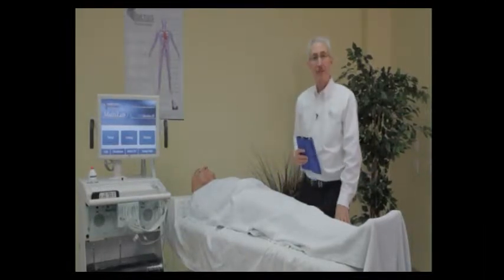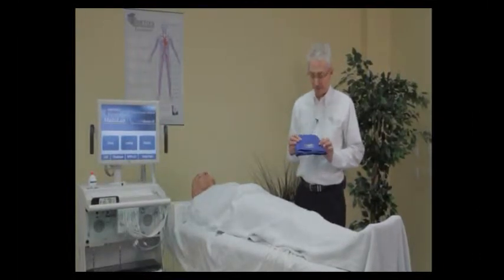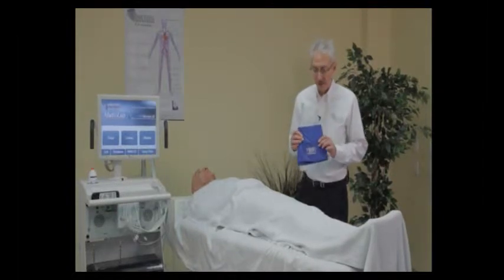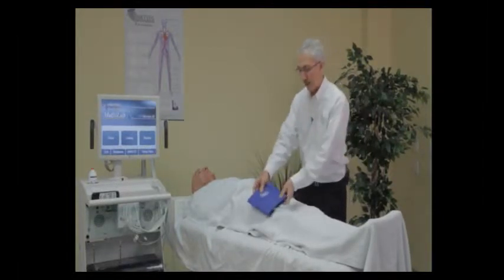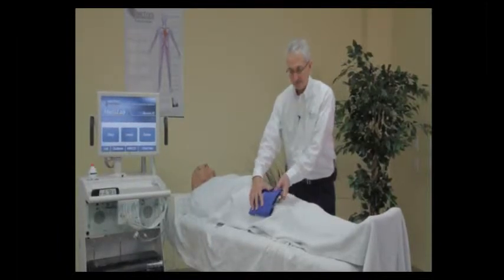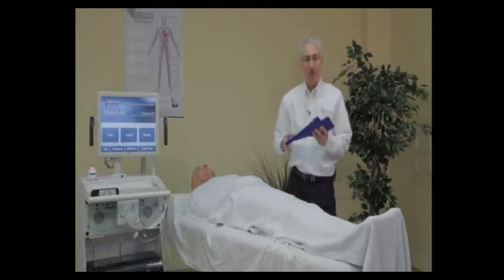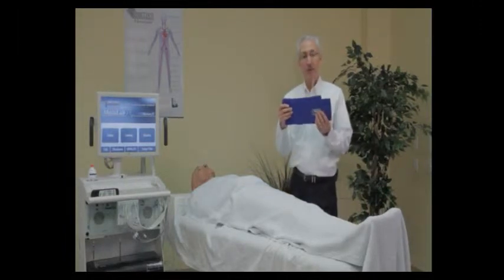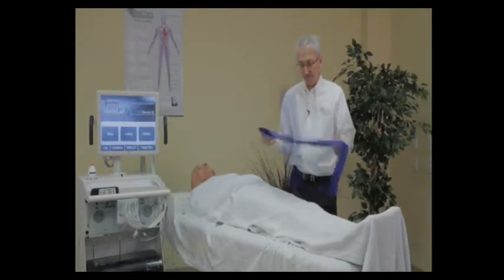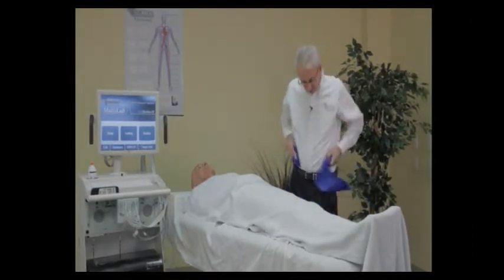I'm going to talk now about cuff selection. We have a wide variety of cuffs, starting with a large 17 centimeter cuff. Some people like to use this one at the thigh level with just one cuff at the thigh in what's called the three-cuff method. The next size is an SC12L — this is an extra-long cuff to go around large thighs. It is 12 centimeters wide but long enough to go around a large limb.